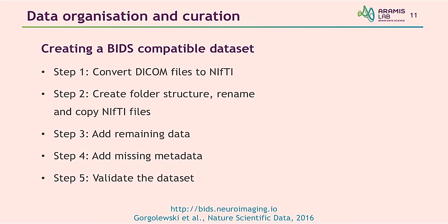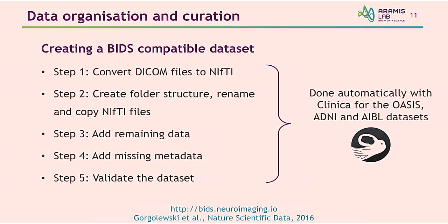This can look like a lot of work, especially for the ADNI data sets. And that's why in Clinica we provide tools to do that automatically. You just have to download your data set and, of course, install Clinica, and then it's just one command line. It's basically clinica convert adni-to-bids, the folder where you downloaded the data and the output folder, and that's the only thing you have to do to have all your ADNI data sets nicely organized. But we also do some data curation. So for example, if you have several MR images for just one session, then it's going to pick the one with the highest quality based on some CSV file that ADNI provides.